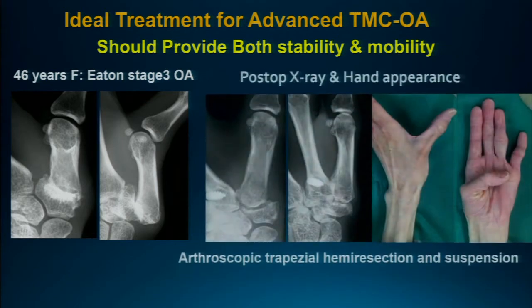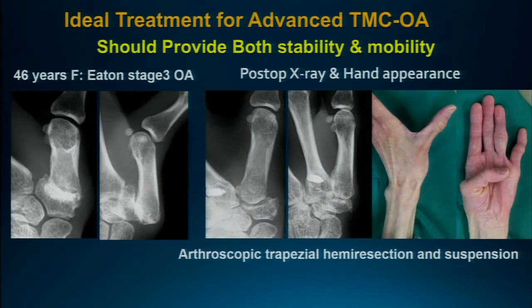We did a surgery preserving the joint mobility, an arthroscopic trapezial hemiresection arthroplasty. And she recovered with both mobility and stability after the surgery.